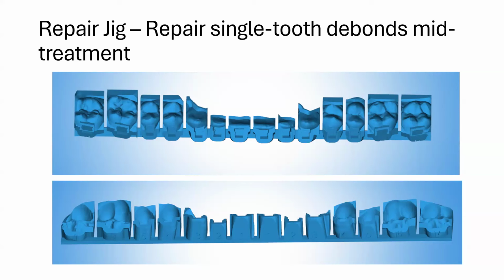Excellent. Okay, I got a long question for you, so buckle up here, Brandon. A rotational wedge essentially adds depth to the base of the bracket. That would create an offset relative to the other brackets. Do you find that multiple brackets will need an offset base to compensate for the wedge?